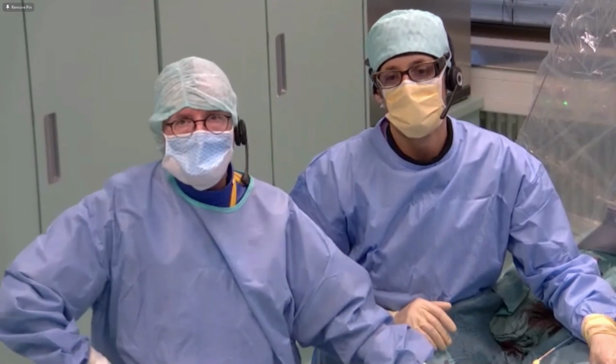Yeah, so I personally never experienced these complications. One point, regarding the ventricular tachycardia, I think you should take a look if patients have bradycardia. I think a pulse below 60 could maybe play some role. Then you may get an effect in the T wave, maybe.